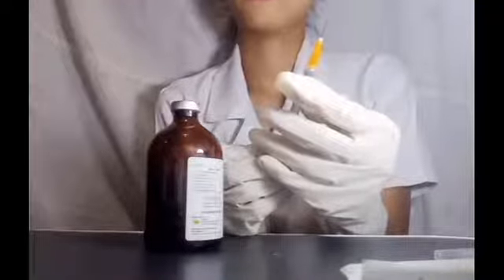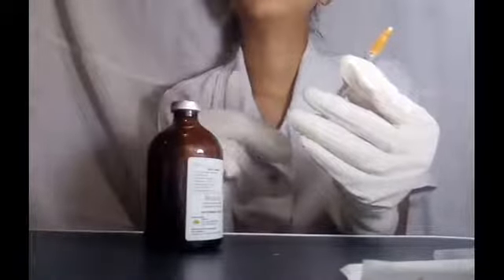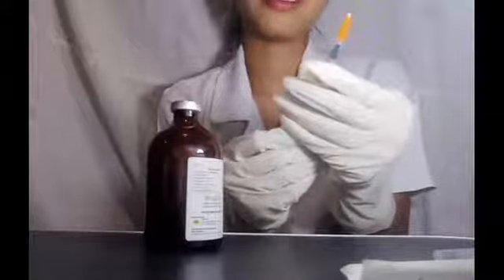The amount of air we draw back is the amount of fluid we are going to take out of the vial. So let's say, for pretend, it's 0.3 ml. So we're going to pull back 0.3.